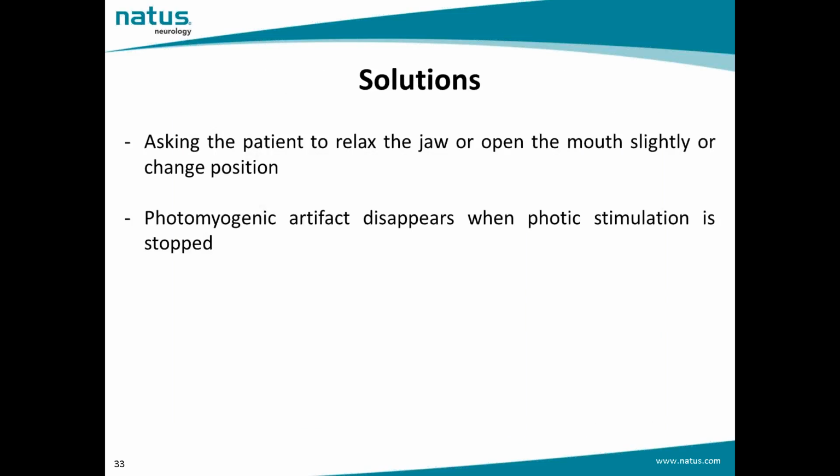Muscle artifact, even if not related to recognizable movement by the patient, is usually easily identified by its shape and repetition. It can be reduced and also eliminated by asking the patient to relax the jaw or open the mouth slightly or change position. Regarding the photomyogenic artifact, obviously it will disappear immediately as soon as the photic stimulation is stopped.